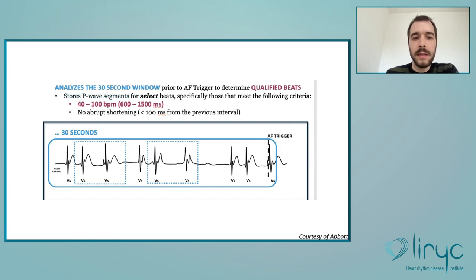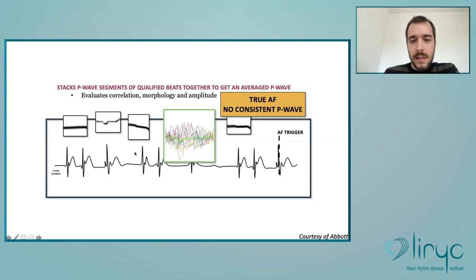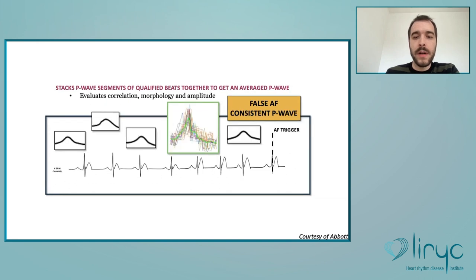So I won't get too much into the details of the qualified beat. So this is what it can look like. So for example, here there is no correlation. There is no consistent morphology or amplitude. So this is not consistent with a P wave. So it's an episode of true AF according to the device. And here, for example, this is a consistent pattern for a P wave. So for the device, it will be false AF.